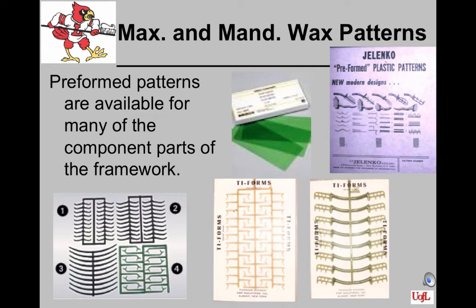The laboratory will fabricate a wax pattern for the framework and often uses preformed patterns for some of the component parts. On this slide, you can see some of the patterns that are available for the laboratory to purchase and use in the development of wax patterns for frameworks.